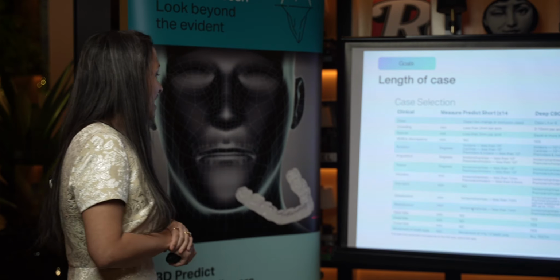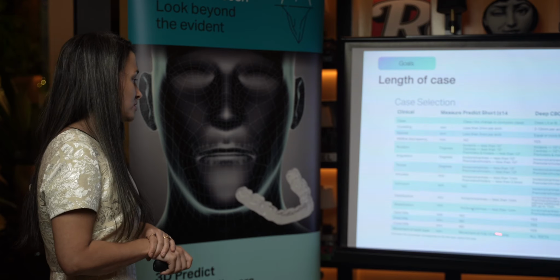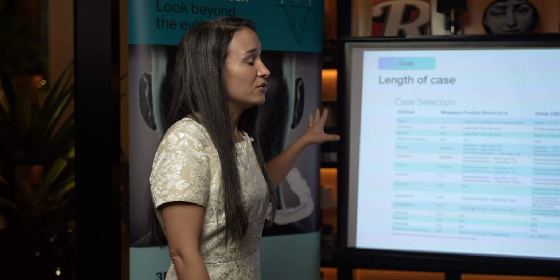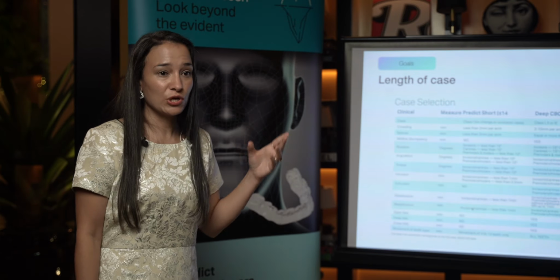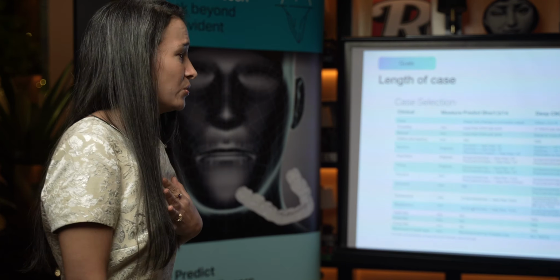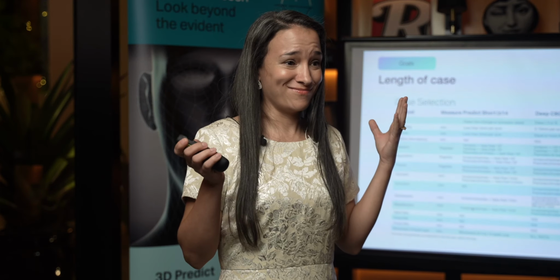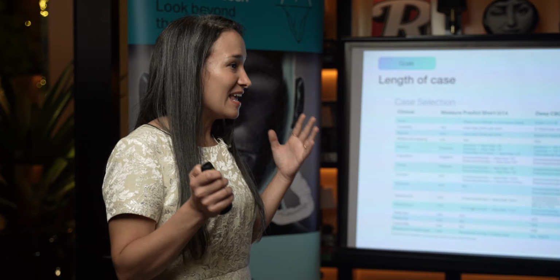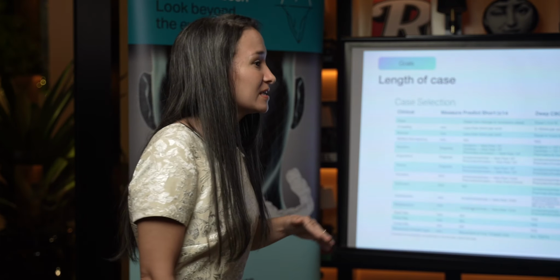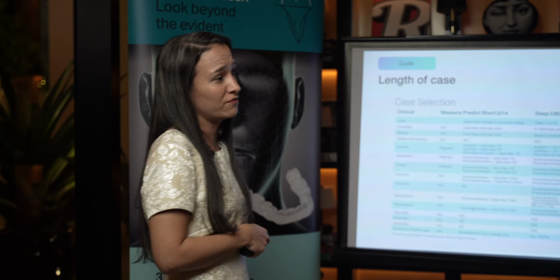Are you treating open bite? Are you treating deep bite? Are you treating cross bite? It is a full case. So those type of things are useful to know when you're first looking at your patient, so you don't overpromise. But as a rule of thumb, I will tell you, please don't ever overpromise your patient. We have all done that, right, in clinical practice, and it has backfired at least once or twice. So it's better to underpromise and then bring the good news to the patient. Oh, by the way, I told you it was going to be 20, but it's actually 14.